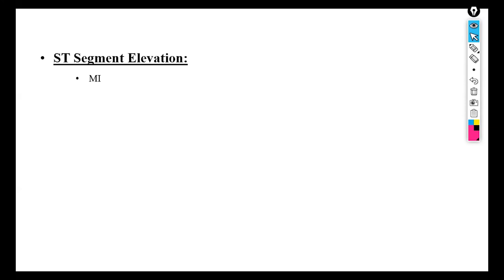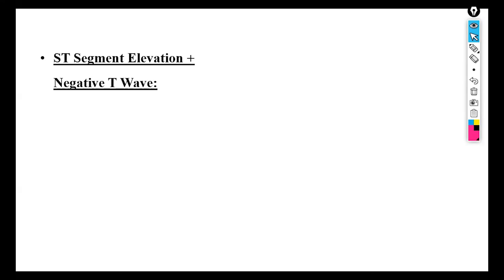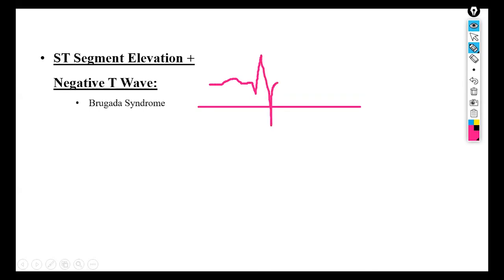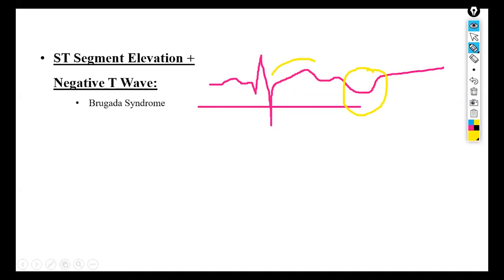ST elevation is a sign of myocardial infarction and also occurs because of pericarditis. It indicates abnormal repolarization — the ST segment of the ECG is elevated above baseline and can also result from recent cardiac injury. When ST elevation is accompanied by a negative T wave, this is because of Brugada syndrome, where the ST wave is elevated and the T wave is negative.